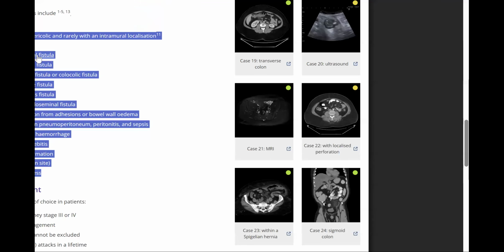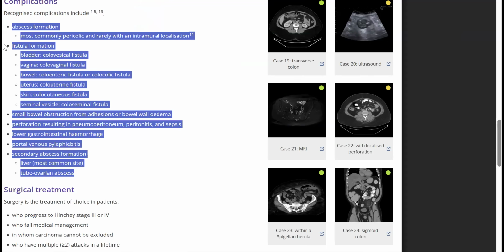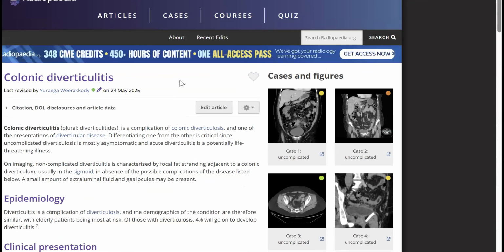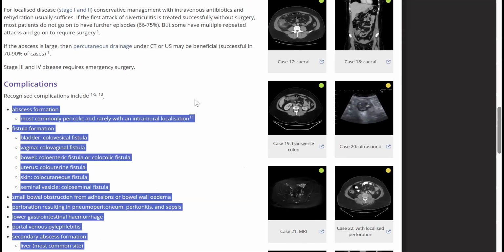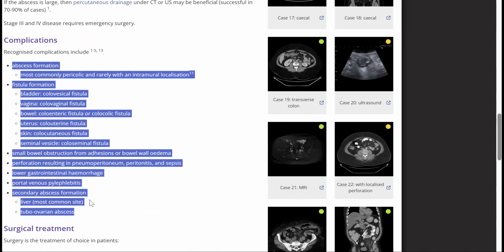Very good. You see, my friend, we are just putting some rules for studying and assessing CT studies for GI emergencies. Look for the inflammatory source and try to rule out the complications one by one. My advice to you is to see Radiopaedia, for example, a topic like diverticulitis. See some cases and as many complications as you can.